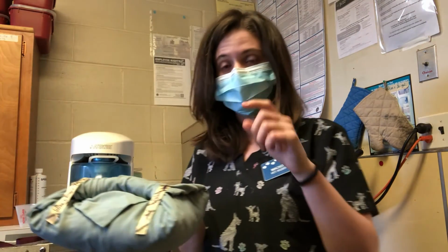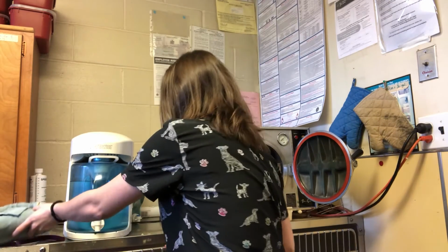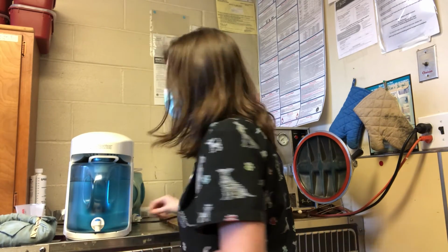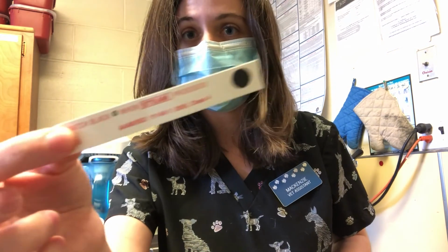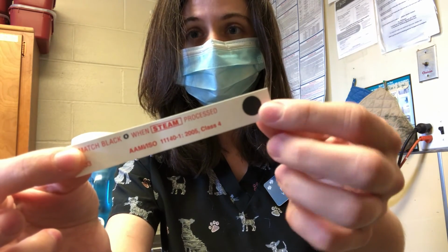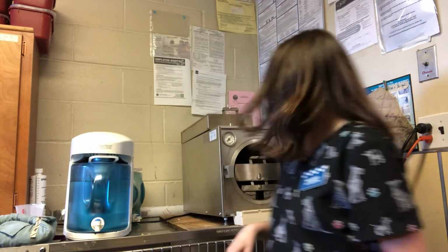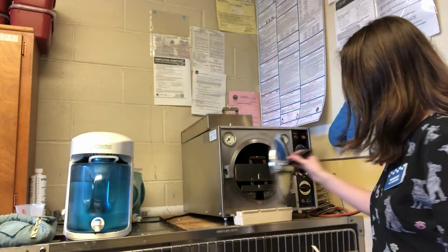And when we would open this pack for surgery, there is an indicator strip in there that also makes sure that the sterilization properly penetrated the pack. So that's what this is, and that's what it would look like. This circle here was originally a pale color, and it turns black when it's exposed to the steam. And that's how the autoclave works.